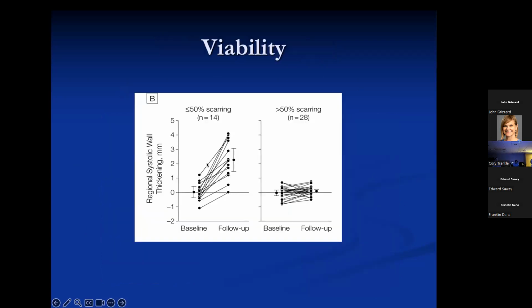And Deepan Shah and Ray Kim did this study where they looked at people who had wall thinning and looked at them from baseline to follow up. If they had less than 50% scarring, they recovered profoundly. If they had more than 50% scarring, not so much.